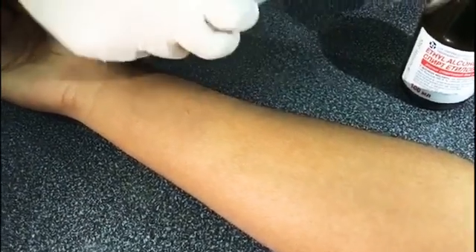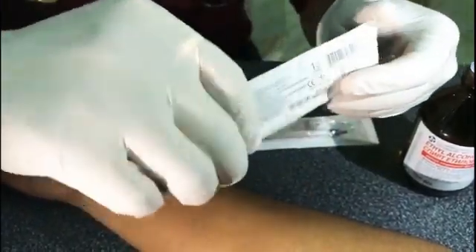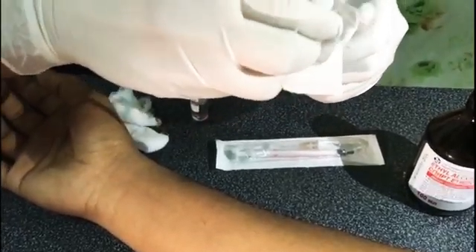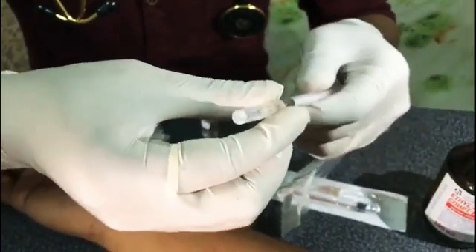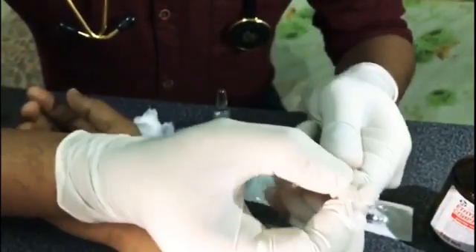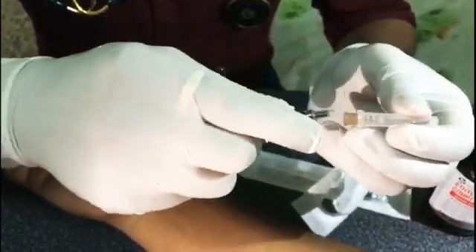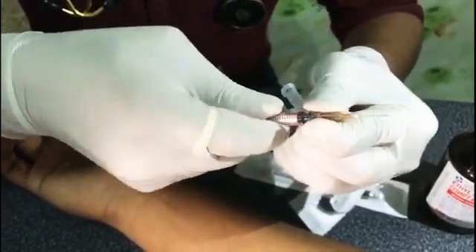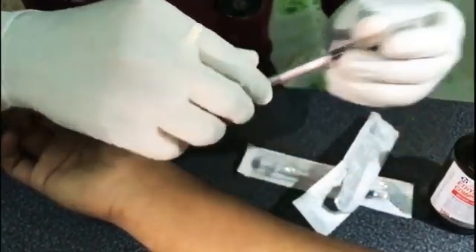Step 2: load your syringe with the ID fluid. Make sure that you handle all parts carefully. Check everything and make sure it is perfect with the syringe before you are going to administer it. Now load the injection.